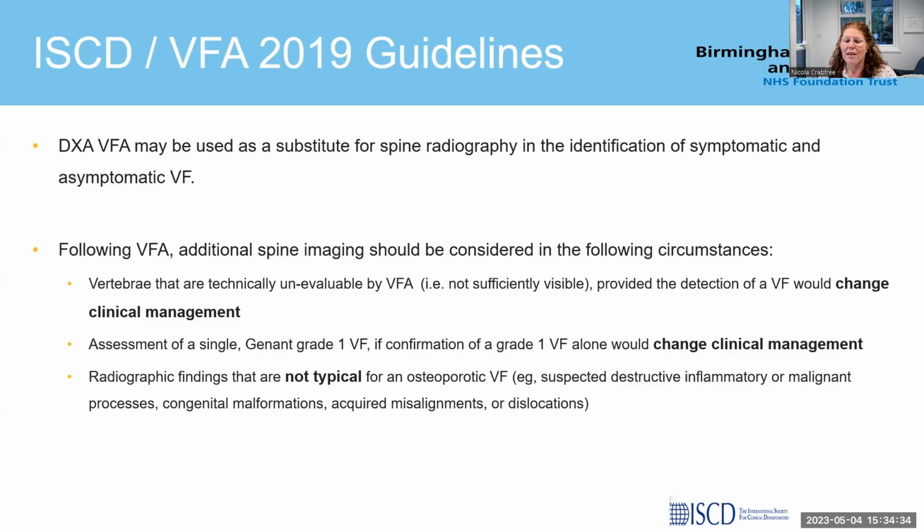Where you've got a single mild vertebral fracture, and again, that the confirmation of that mild fracture would change clinical management. And then when the findings are not typical of an osteoporotic vertebral fracture, and as I said earlier, VFA isn't a substitute for alternative imaging. When you're looking for other things such as destructive inflammatory or malignant processes, then you need to do further imaging.